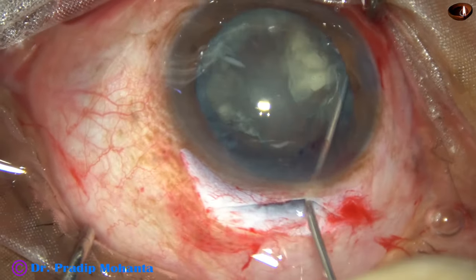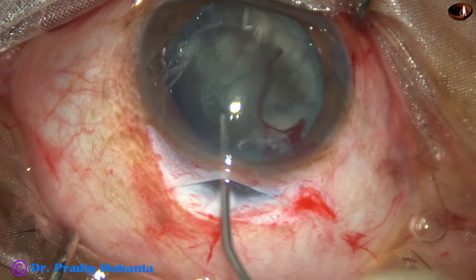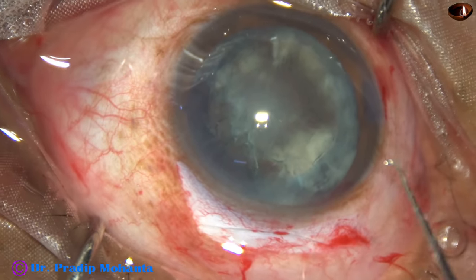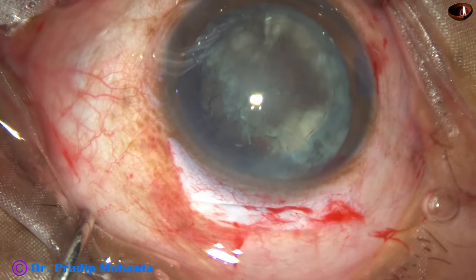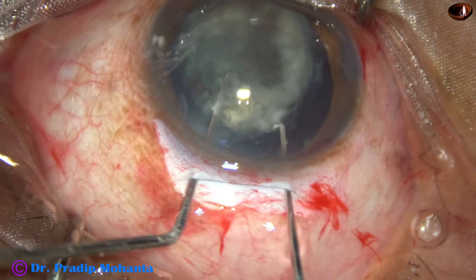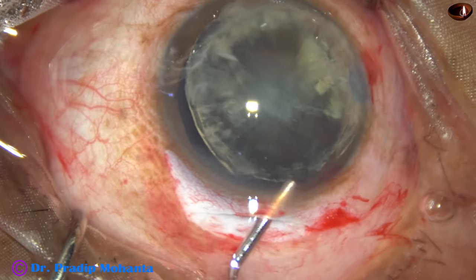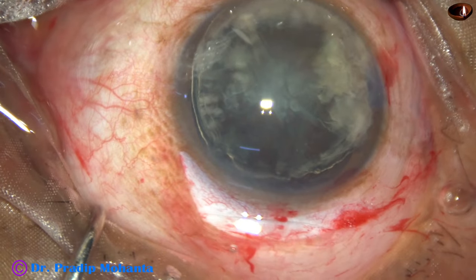The nucleus is free, I can see. But it did not prolapse because the rhexis is on the smaller side. Inject visco. Now I use two hooks to prolapse the nucleus into the anterior chamber. I get one edge that is part of the equator — one hook is underneath, another on the anterior surface. Just by dialing the nucleus, we can get it out of the capsular bag. And it is in the anterior chamber now.